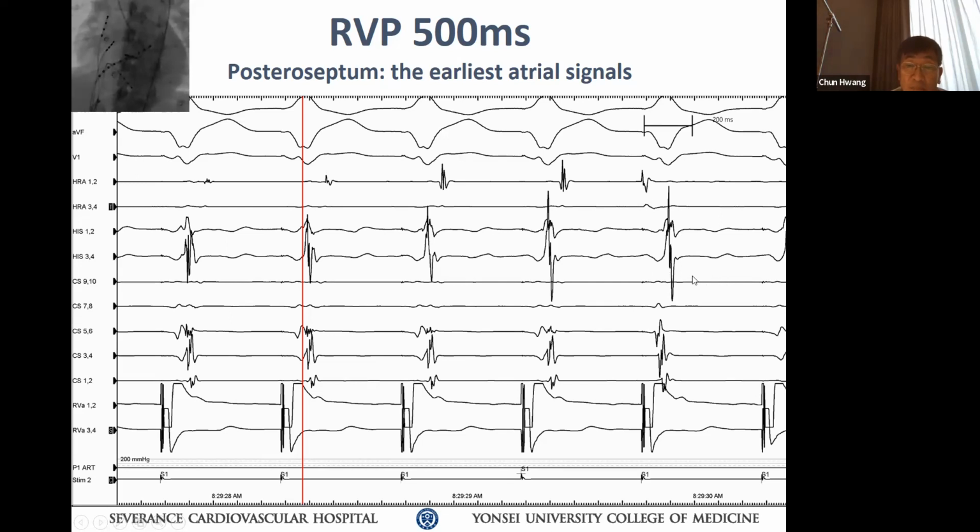One of the points I made here was this. We know that CS, now let's go back to the CS electrogram. You have a very sharp potential. Initial vector polarity reversed, 5, 6, 3, 4, right? Now go back to that HR capture beat, number 5 beat. What do you see? Now here you can tell what belongs to A and what belongs to V.